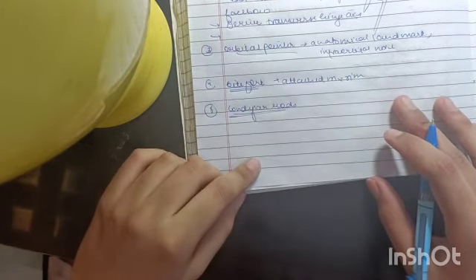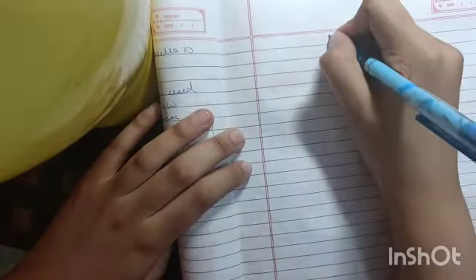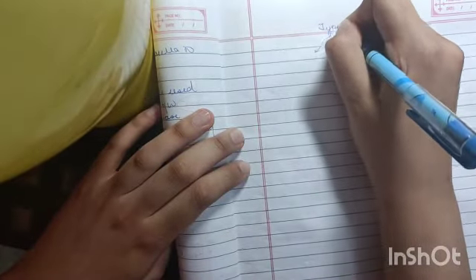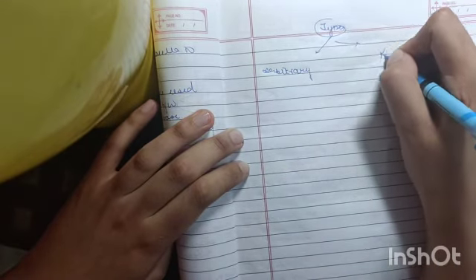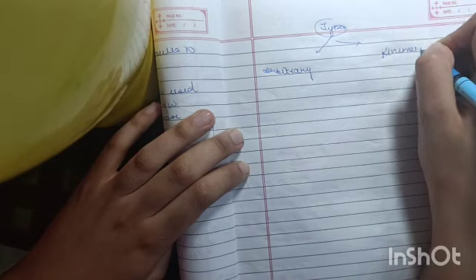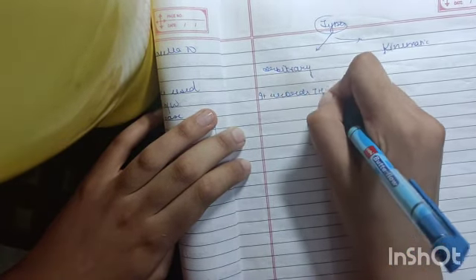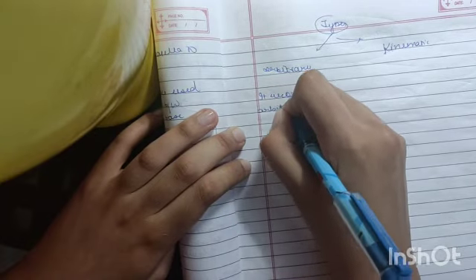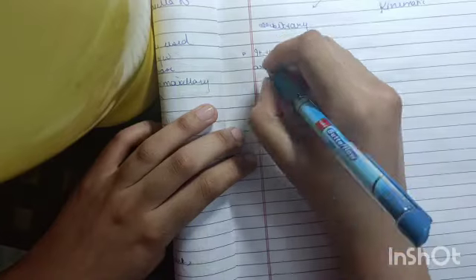Now coming on to the types of face bows. There are basically two types of face bows. One is arbitrary and another one is kinematic. The basic difference is that arbitrary records the transverse hinge axis arbitrarily. That is, it is not the accurate representation of the transverse hinge axis.